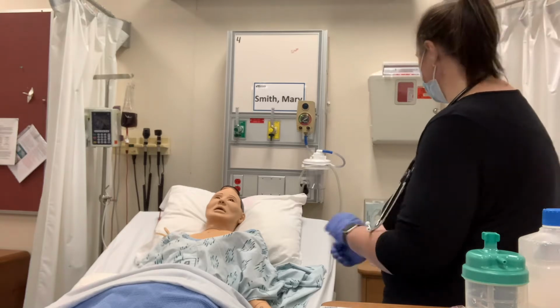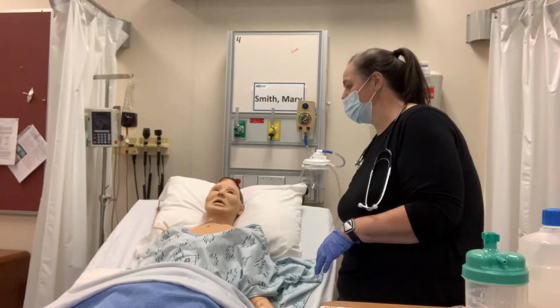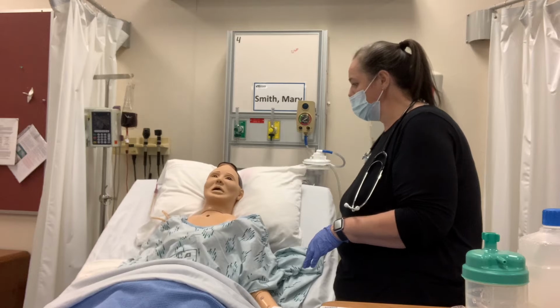Oh, I'm sorry to hear you're feeling a little short of breath. Let me raise the head of your bed. I'll put you in a high Fowler's position. Hopefully that'll help you feel like you're breathing a little bit easier. Does that feel a little bit better?